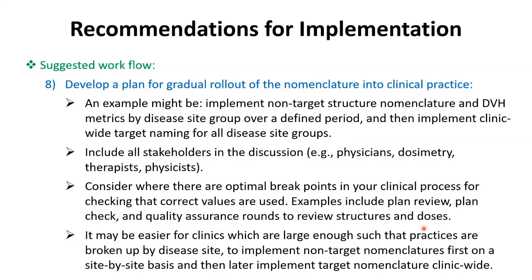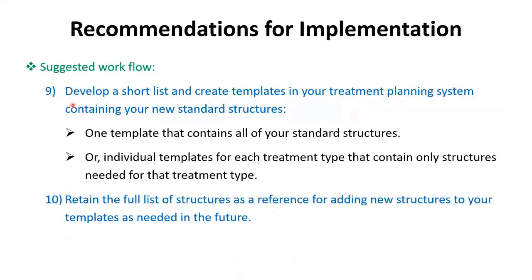written correctly. It might be easier for clinics which are large enough, such that practices are broken into disease sites, to implement non-target nomenclature first on a site by site basis, and then later implement target nomenclature clinic wide. Develop a short list and create templates in your treatment planning system containing your new standard structure.